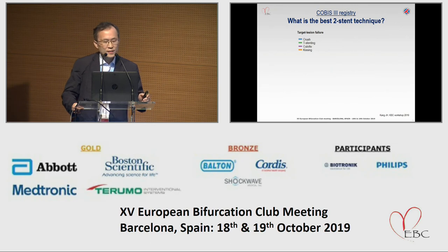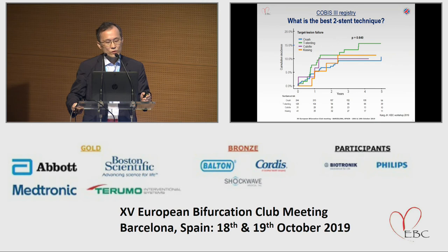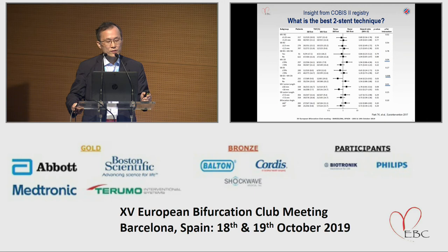So what can be the outcome of these different technologies, crush, T, culotte, kissing? In terms of five-year outcome, there was no difference. So I think that, as it is frequently said, the best one is the one which you are most familiar with.